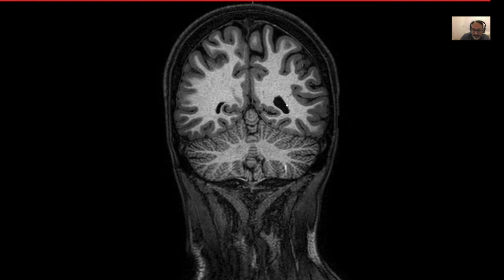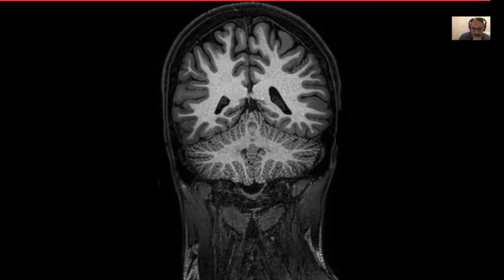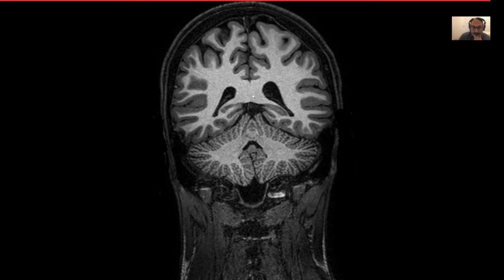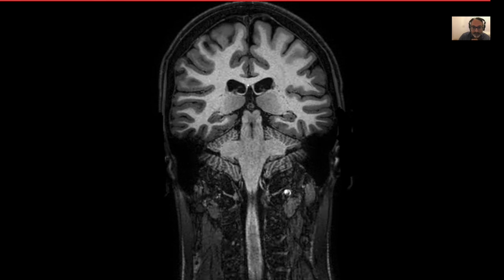These two are the occipital extensions of your lateral ventricles. They will slowly start getting bigger and moving medially. This is the posterior aspect of your corpus callosum, which connects the two sides. That's your corpus callosum up there.